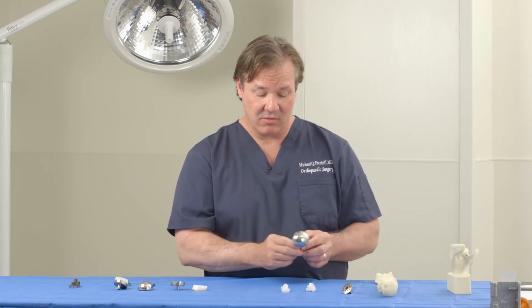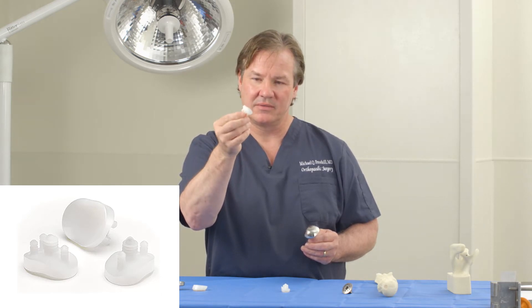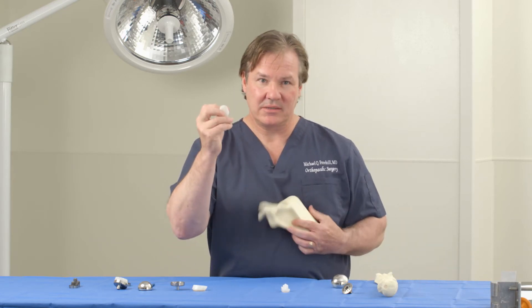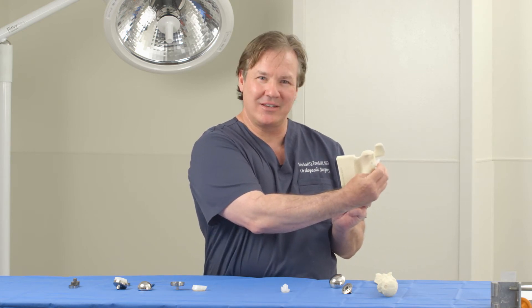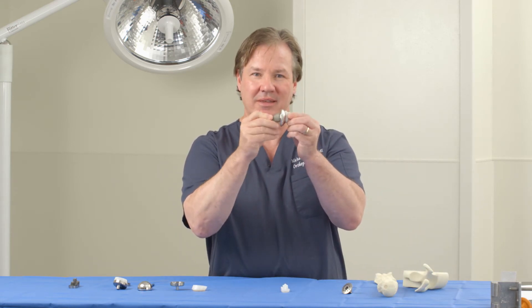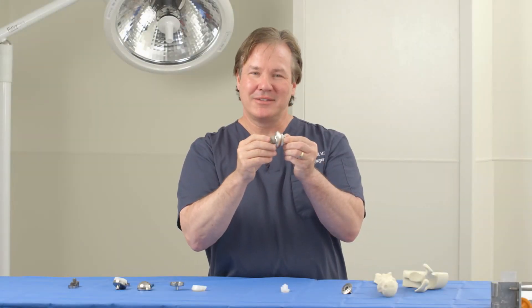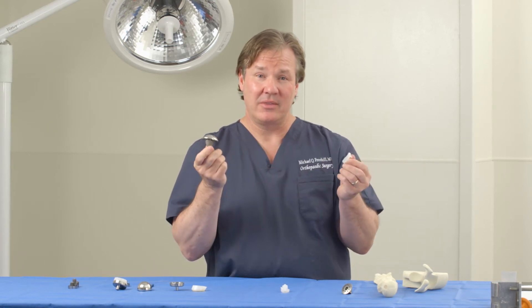This will articulate with a new socket. Currently we use a socket made of polyethylene — a special type of plastic that's quite durable — which is placed inside the socket. Ultimately, these two parts create a relationship where the ball articulates with the plastic portion, creating a pain-free shoulder for you to play guitar, play tennis, and enjoy all the fun things you like to do in life. That's what we call the anatomic total shoulder.